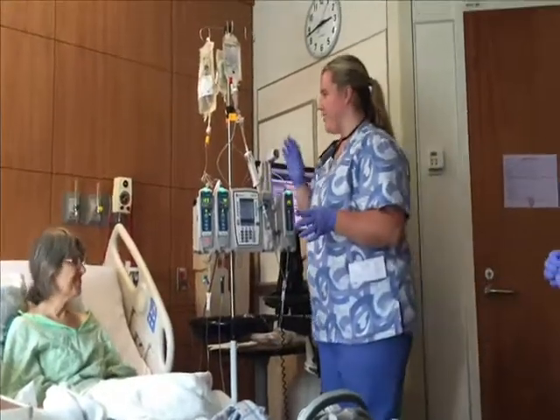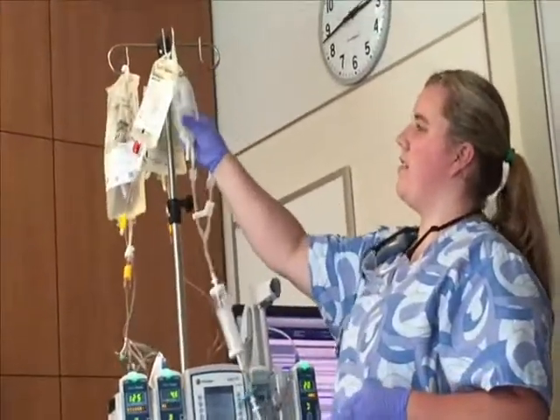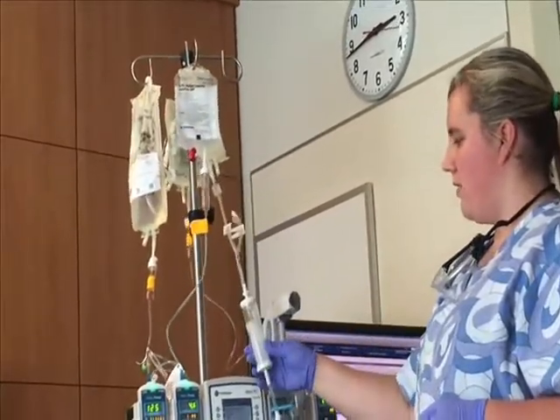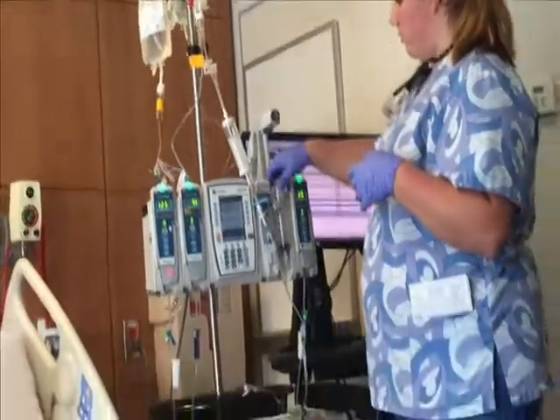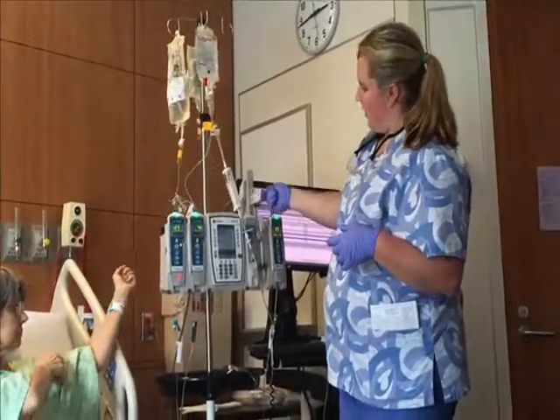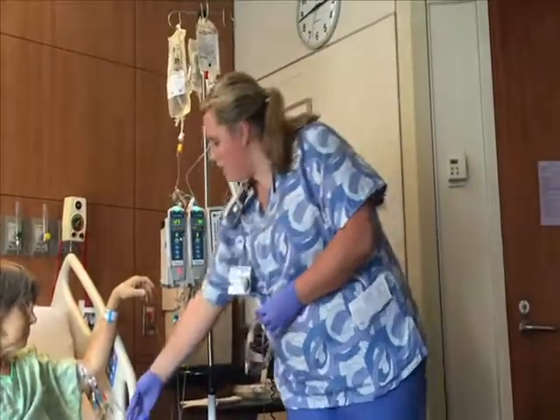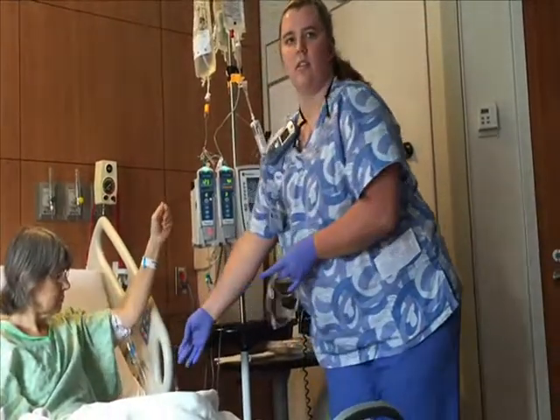Okay, cool. So the stem cells are gonna go hopefully on this hook, and then we're gonna connect here. You have just a bag of saline. They're gonna go through to the filter. There's gonna be a lot of clamping and whatever. So I'll just pull it up through this syringe, and then this guy right here, as you can see, can go up and down. So it's just gonna push it through the tubing, which will be connected to this tubing, and then it just goes through our central line. Okay. So that's how it works.